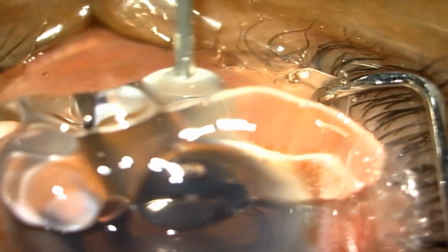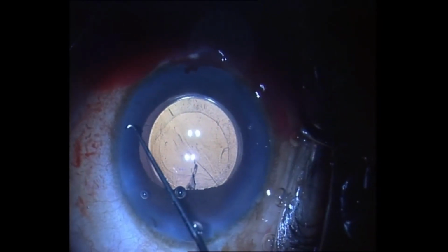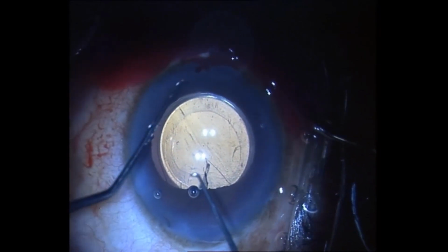After phacoemulsification, the AC is formed with high molecular weight viscoelastic. A Swan-Jacob lens is used to visualize. The angle-left hook is used to incise the supranasal angle and the angle-right hook to incise the infranasal angle. The hook is inserted into the anterior chamber through a 2.8 mm clear corneal incision to approach the nasal angle. It is inserted into Schlemm's canal and moved circumferentially over the desired clock hours to incise the trabecular meshwork and the inner wall of Schlemm's canal.